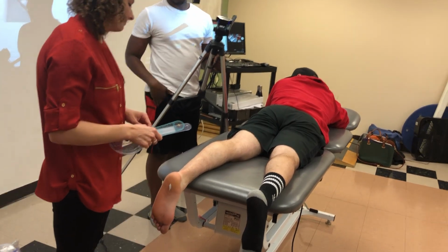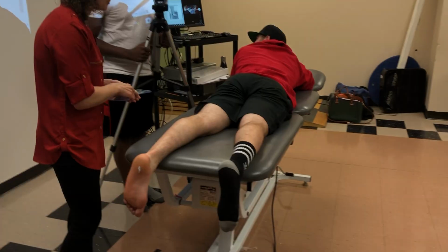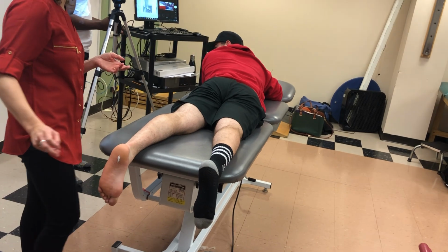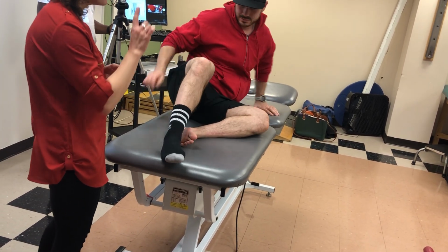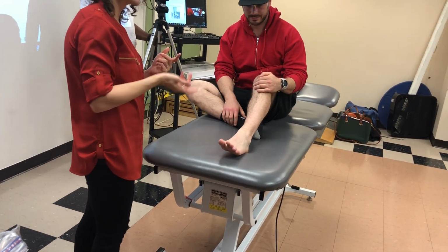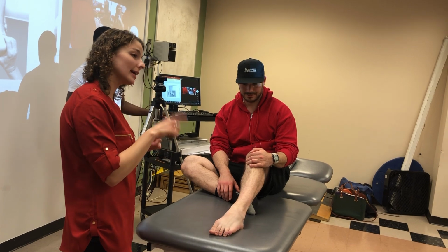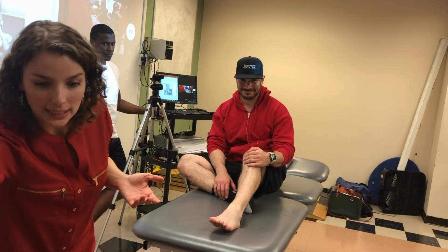All right. We're only going to do one more here today, so why not just finish up with big toe extension. There are other toe range of motion measurements. I'm going to have you guys reference Physio U for those, because they're pretty straightforward. But first MTP extension is a really important one, like we talked about in the beginning. For gait and for elevating onto the balls of the feet, we need about 60 degrees of first ray extension. So to be able to measure this is an important one in the clinic.